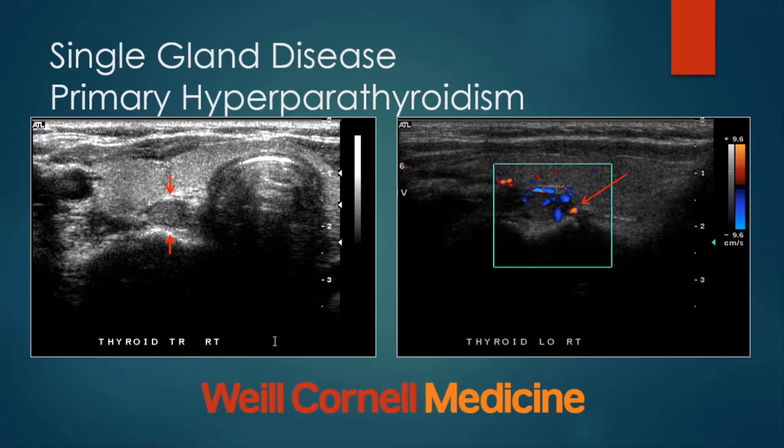This patient with single glandular disease and primary hyperparathyroidism: a hypoechoic lesion just behind the thyroid — turn on the Doppler and there is the polar artery — high positive predictive value for a single parathyroid adenoma.